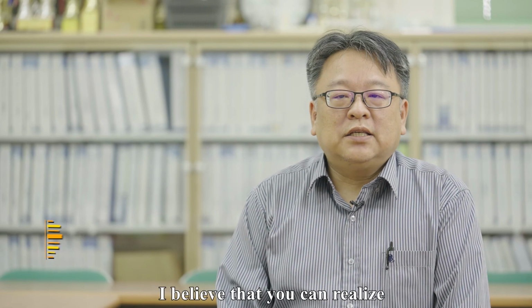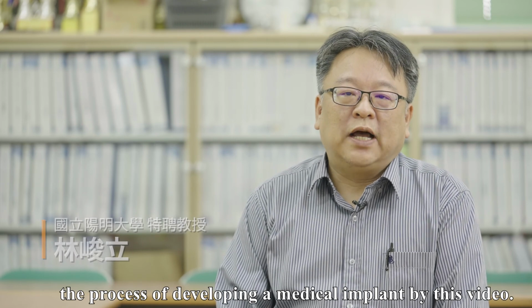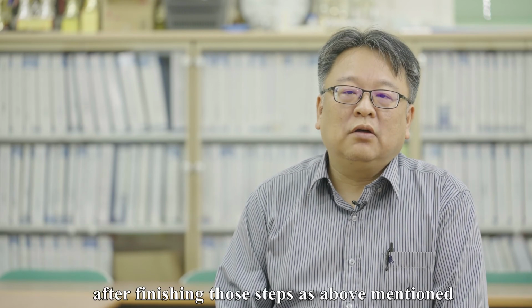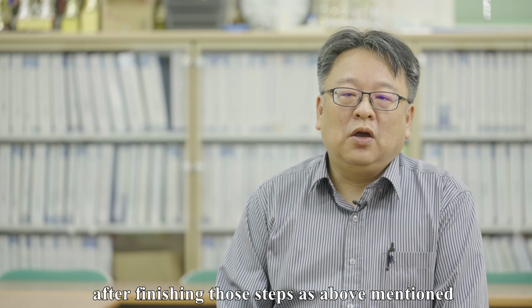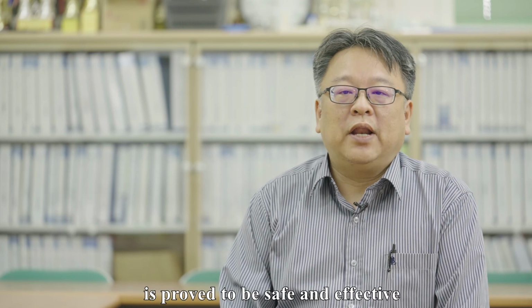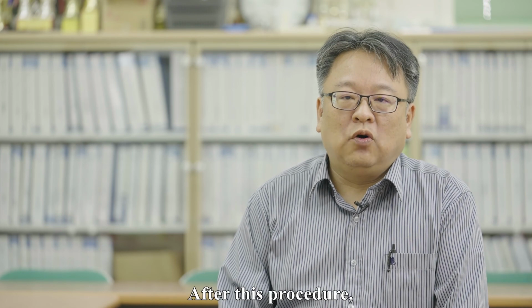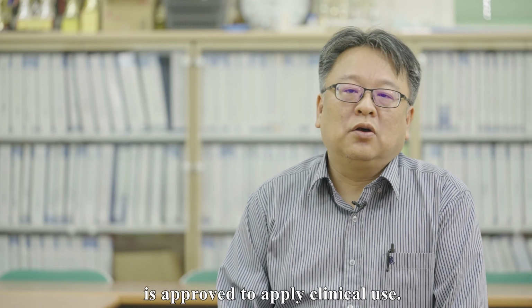I believe that you can understand the process of developing a medical implant from this video. Moreover, after finishing the steps mentioned above, we have to prepare documents for TFDA or FDA examination. Only when the medical implant is proved to be safe and effective should it be launched onto the market. After this procedure, the medical implant is approved for clinical use.